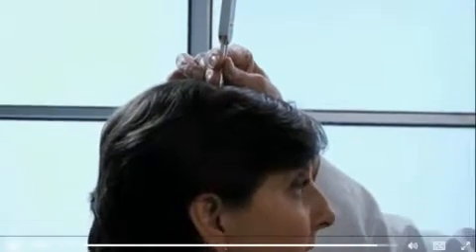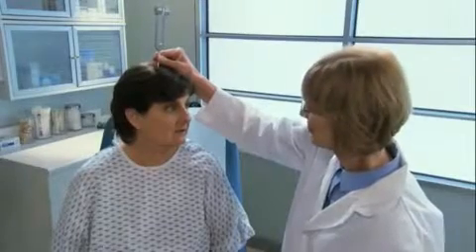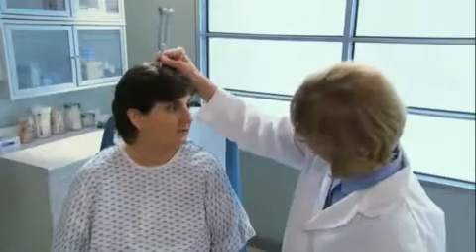Place the base of a vibrating tuning fork firmly on top of the patient's head or on the mid-forehead. Then ask, "Is the sound louder in one ear or the same in both ears?" It's the same in both ears. Normally, the sound is heard in the midline or equally on both sides.